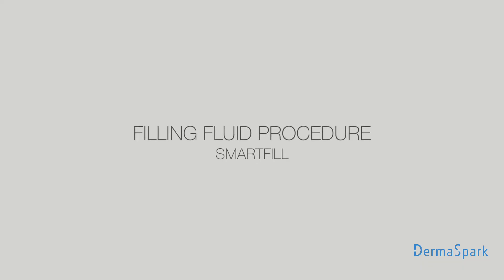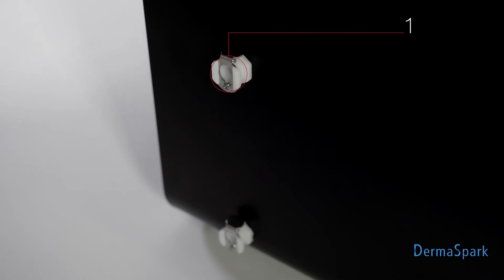Select the room. Fluid filling procedure — Smart Fill. Step 5: Prepare the refill kit. Connect the tube to the upper connector on the back of the device and insert the other end into the bottle.